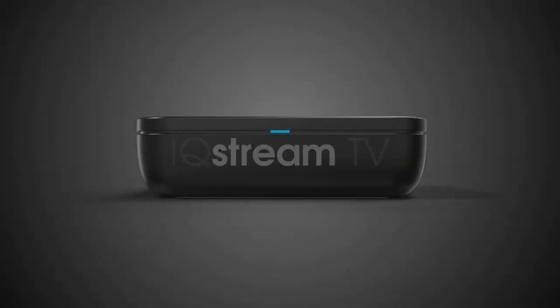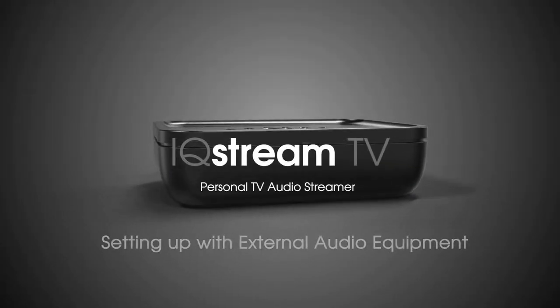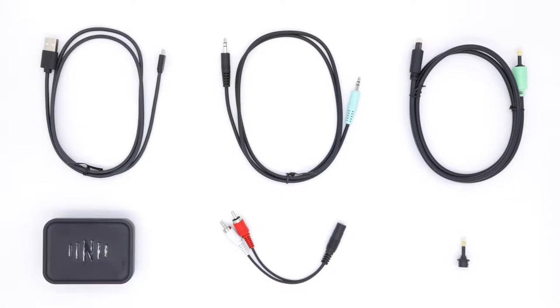Thanks for buying the Nuheara IQ Stream TV Personal Audio Streamer. When first unboxing, check you have all the items in the box. You will have six items.